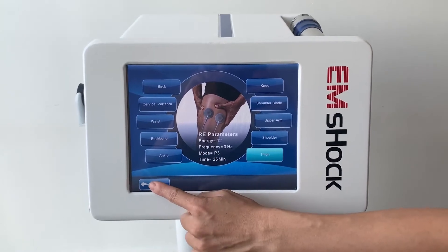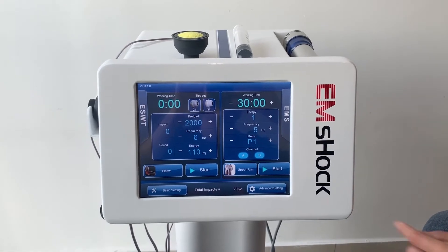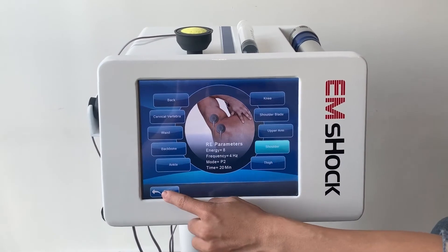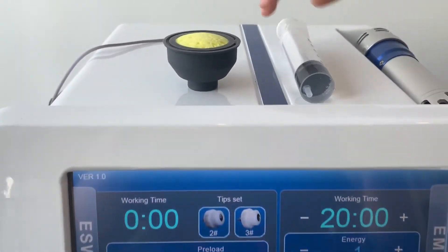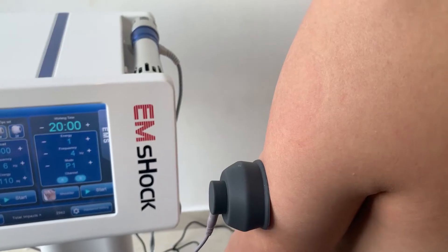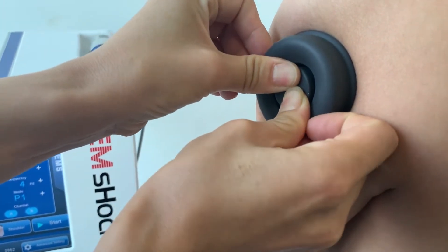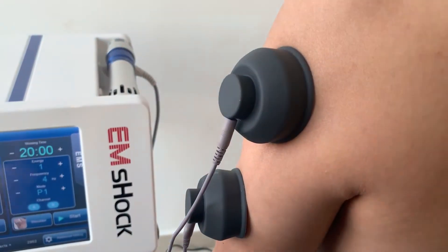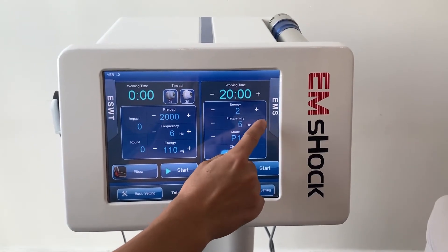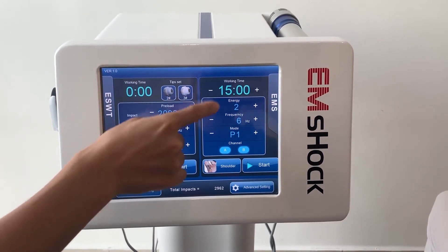Clearly, you can understand how to use it. We choose EMS and select the body part. Then put water or a special product in a sponge. Press the self-vacuum cup and make sure they are well located. Increase the energy level according to your tolerance, and set a timer — for example, 15 minutes.